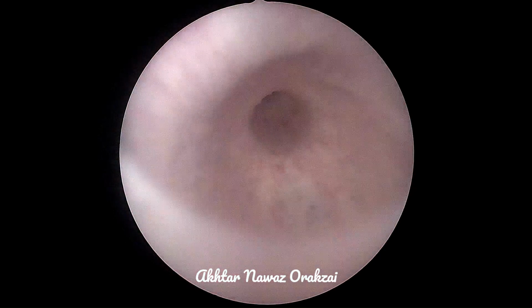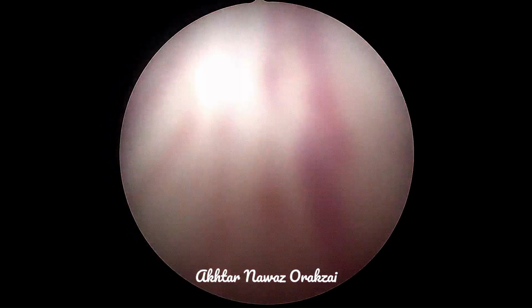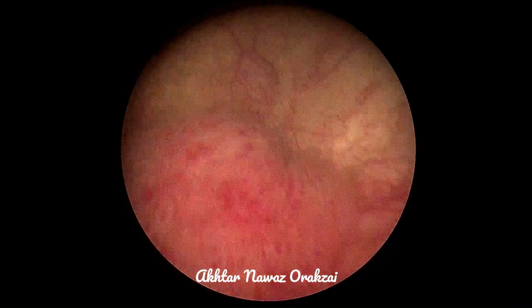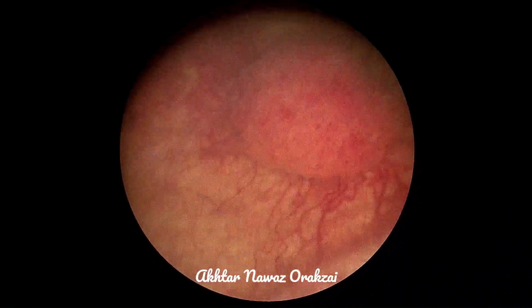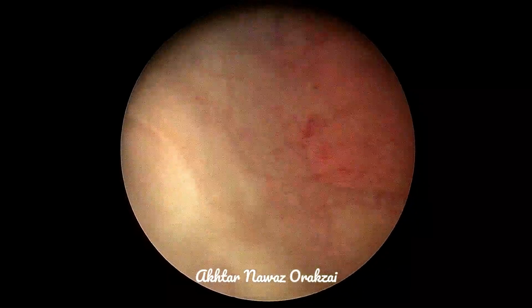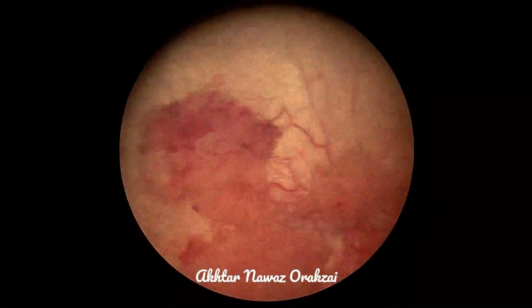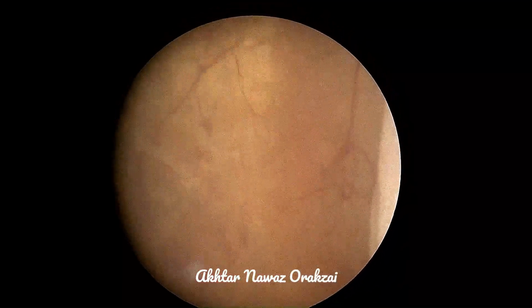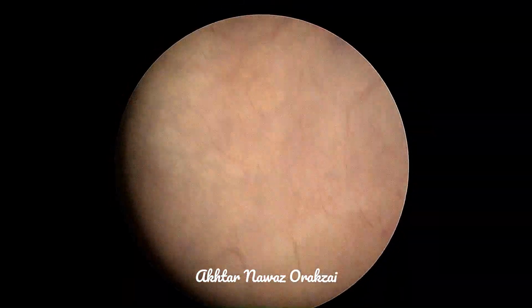So our transurethral resection of the bladder tumor here. We saw soft strictures, the bladder neck, and these are the tumors. The number is noted. You can see that the previous resected area was on the trigone and near the right ureteric orifice. So we look for tumors elsewhere.